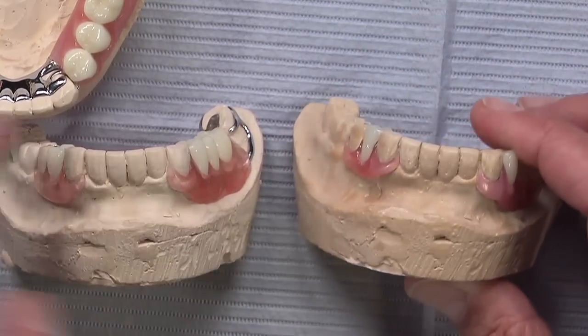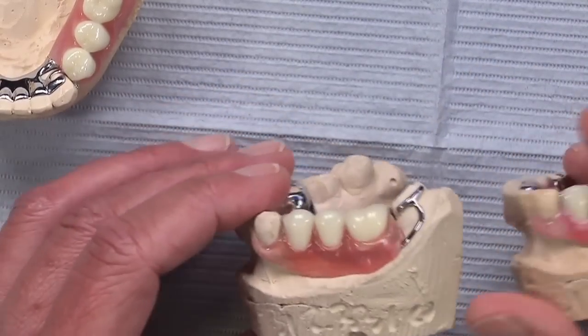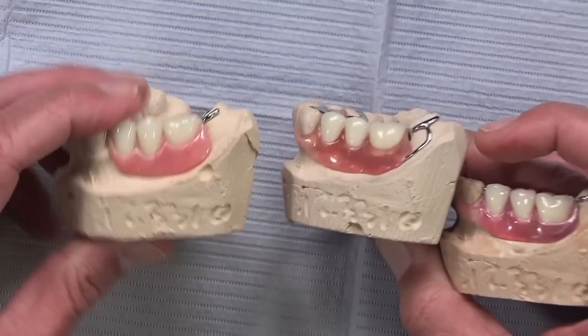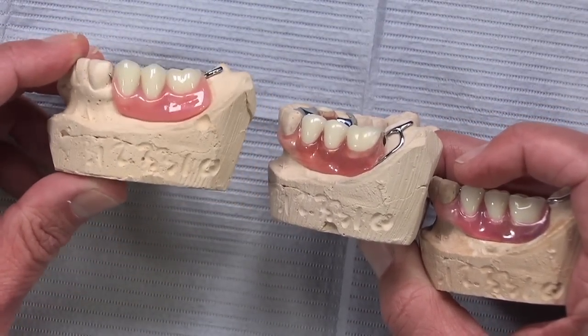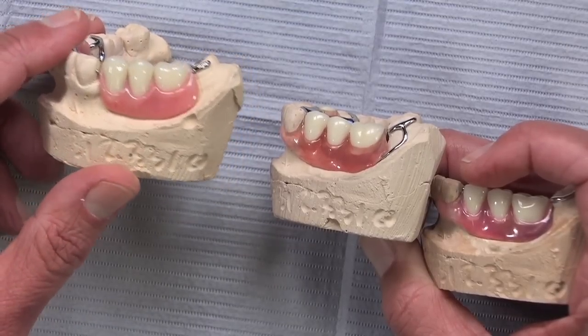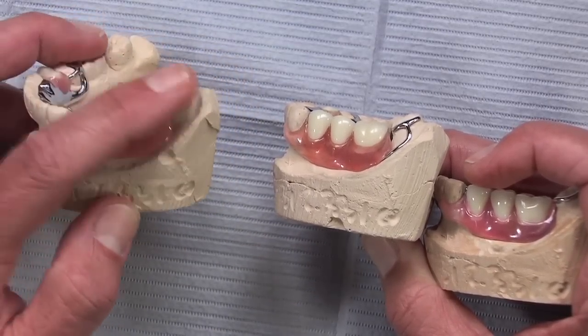It won't come off, in other words. Aesthetically, if we look at these two, like the Duraflex and the Valplast, or even if we bring in the acrylic as well, we're all familiar with what that looks like. That is the typical standard gingival acrylic, and it's pink, obviously, so it comes closer to matching gum tissue than obviously the teeth or the clasps do.